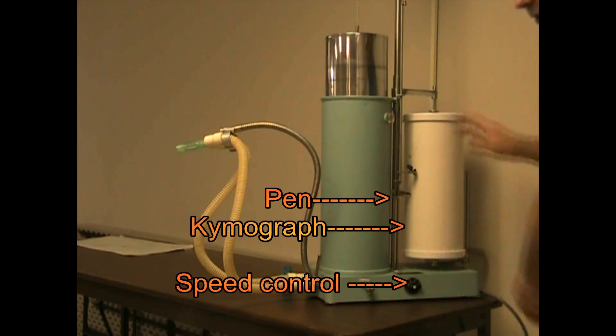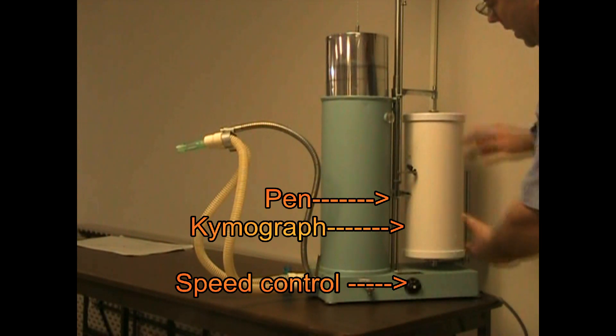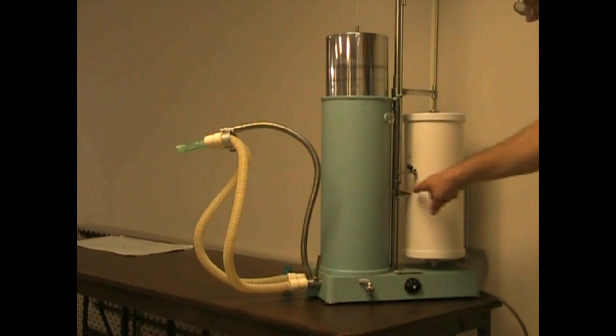Over here is the kymograph, which in a little bit we will put some graph paper on. This is where the pen will record the movements.